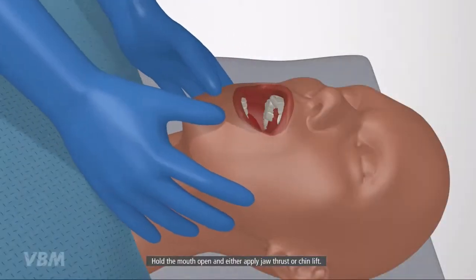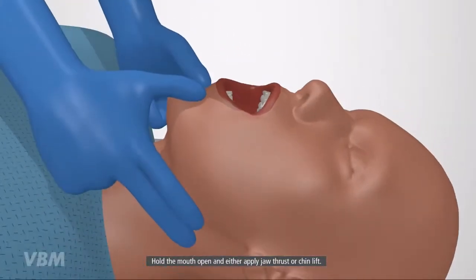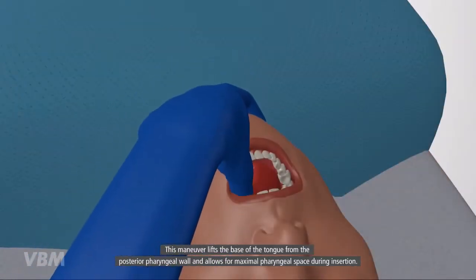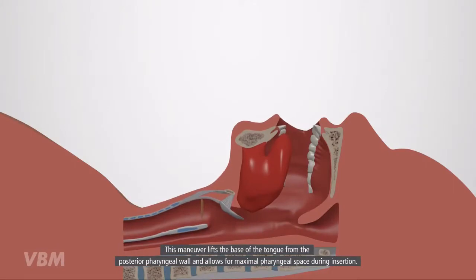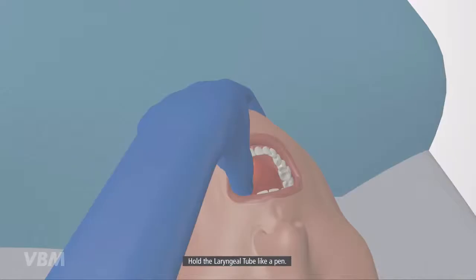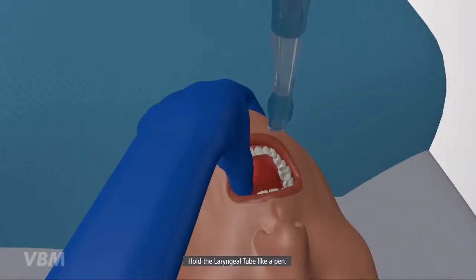Hold the mouth open and either apply jaw thrust or chin lift. This maneuver lifts the base of the tongue from the posterior pharyngeal wall and allows for maximum pharyngeal space during insertion. Hold the laryngeal tube like a pen.